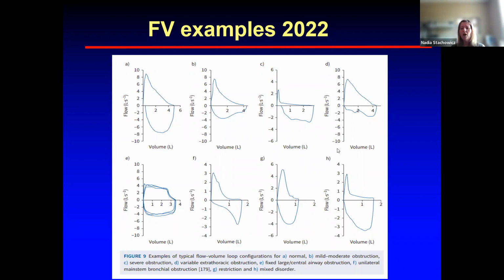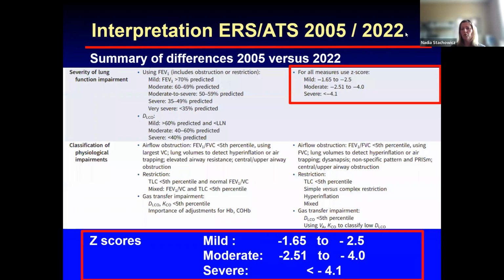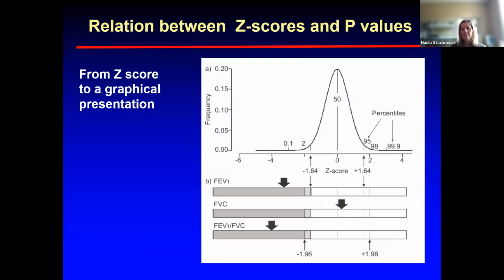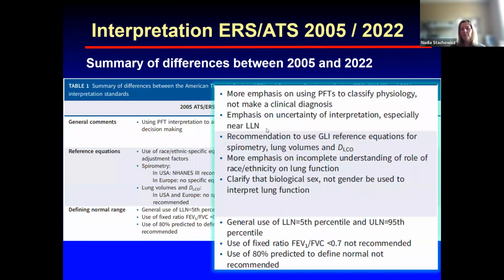and it was on Frans's screen. She did talk about this, and the guideline, if we look here, does discuss it, that we need to take a little more care about the impact of ethnicity. But if we think about the social determinants, there are so many things that impact lung function that it's difficult to really know at this point. It seems like it's probably just based on the recent GLI race neutral equations that came out. It appears that it's just going to almost give you a bigger bell curve, so to speak. But Frans, what do you think about that?